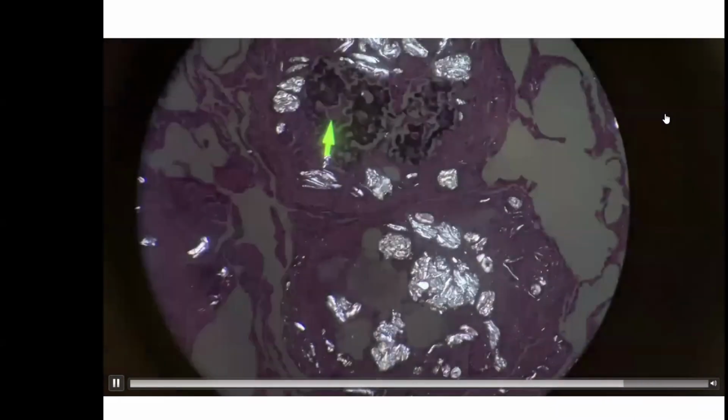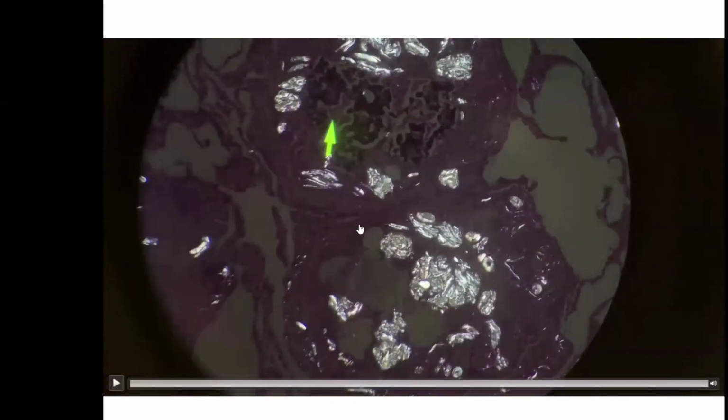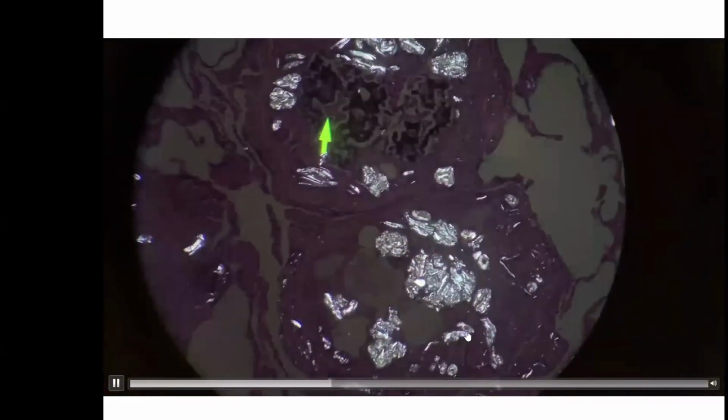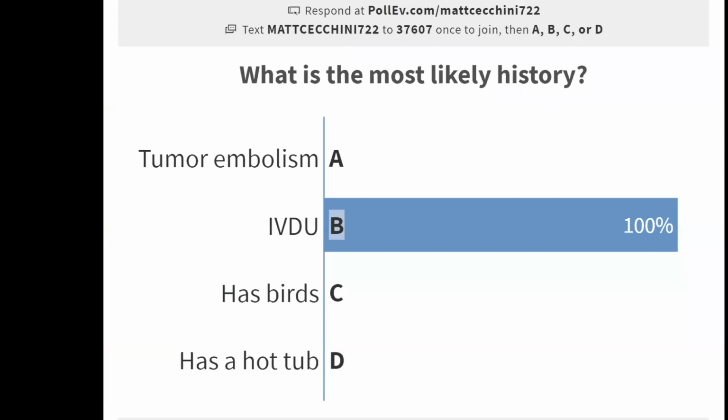And that's the paper that Dr. Mukhopadhyay has highlighted. And I actually learned about how to recognize these different materials from a tutorial he did a few years ago on it. That was excellent and really teaches you how to differentiate between these different pill fillers. Great job.